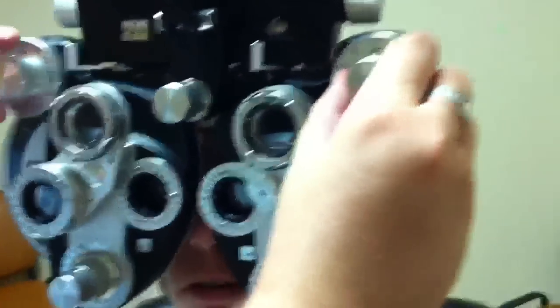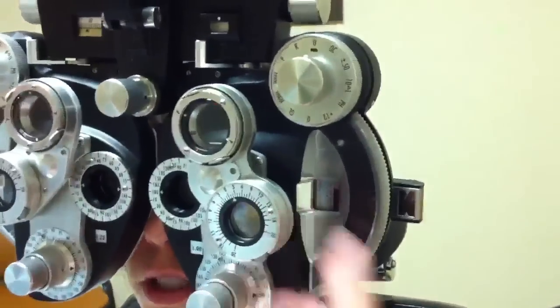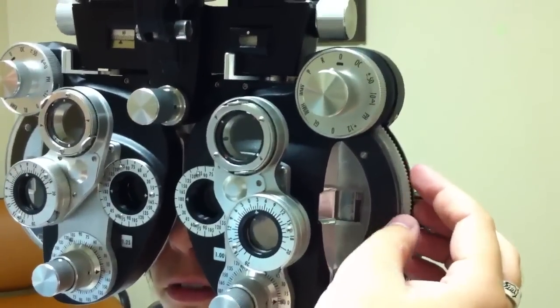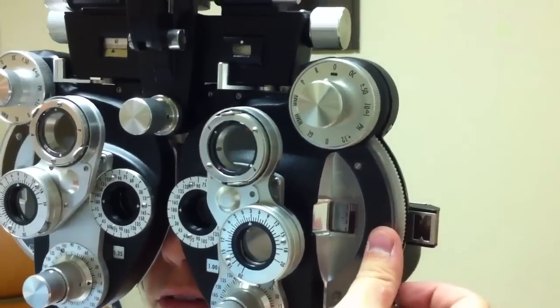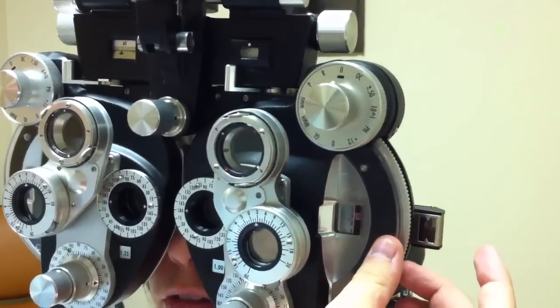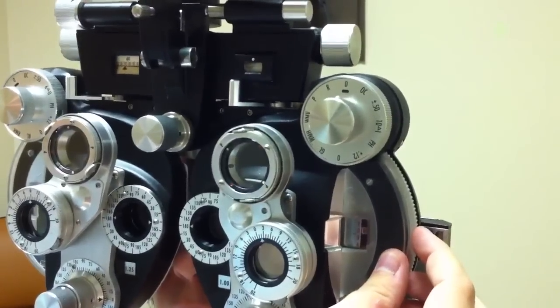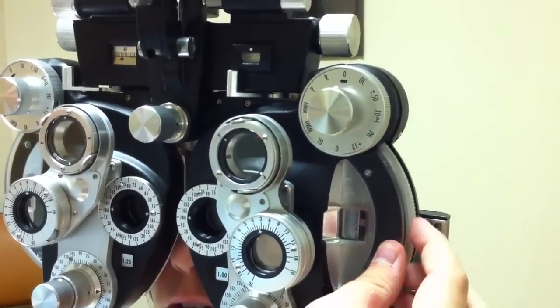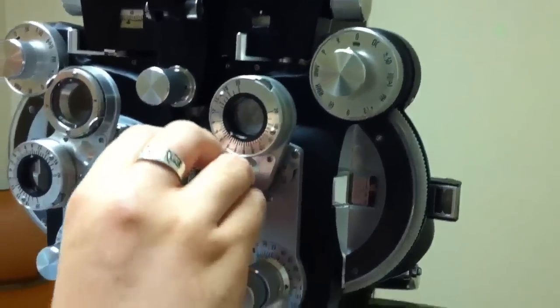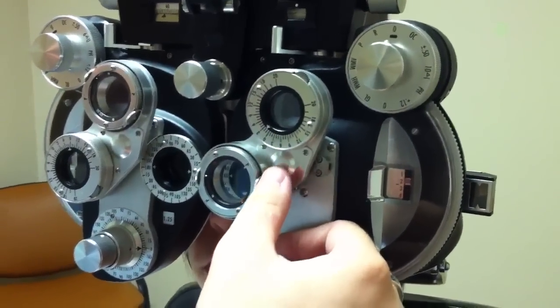So we can move over and do the same thing to the left eye. What's the smallest you can see? E-V-O-T-Z. Once again, I'm going to go one above, one below, to see if she wants more plus or minus. One or two? E-V-O-T-Z. And two or three? Two. She wants one more minus. I don't want to go two minus because people who are myopic like a lot of minus, so I'll just give her one and we'll check it out later.